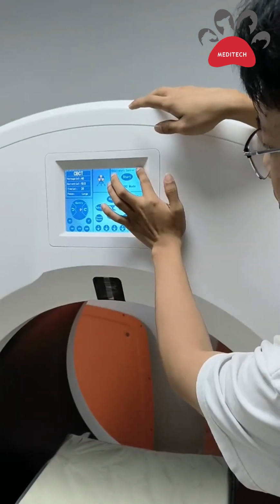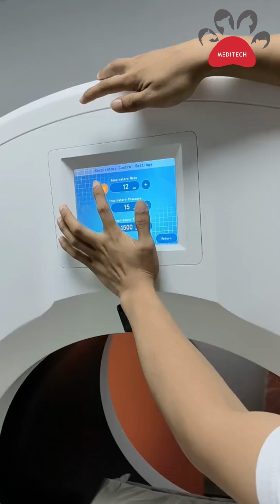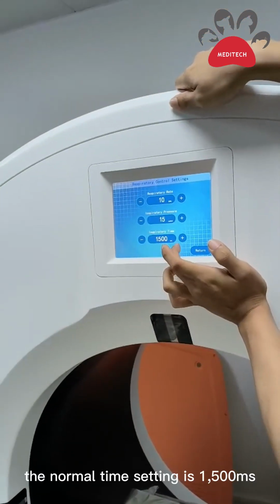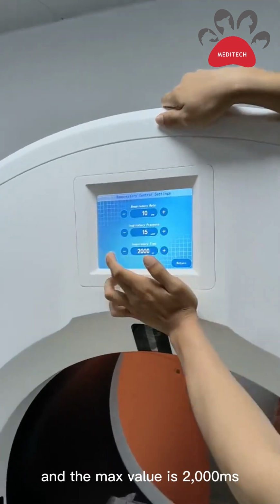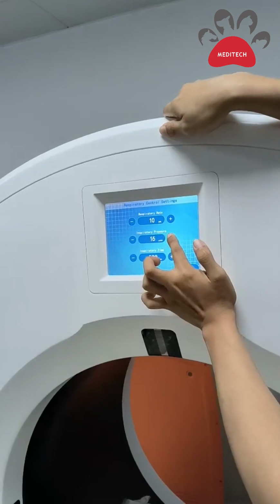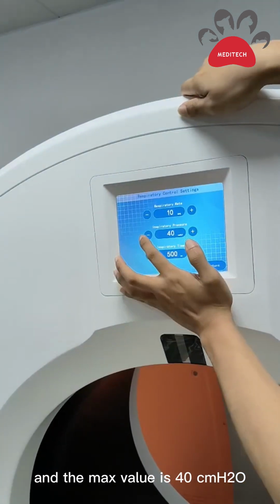Then, the setting on the right corner can set the respiratory rate, inspiratory pressure, and inspiratory time. The normal time setting is 1,500 milliseconds, and the max value is 2,000 milliseconds. It is 2 seconds, and the min time is 500 milliseconds. And the value of inspiratory pressure is usually set between 15 to 20, and the max value is 40.